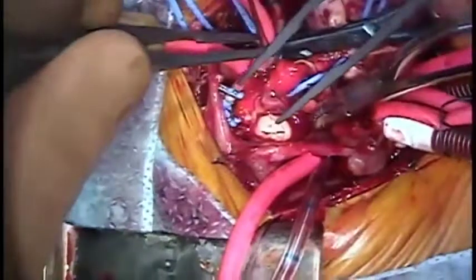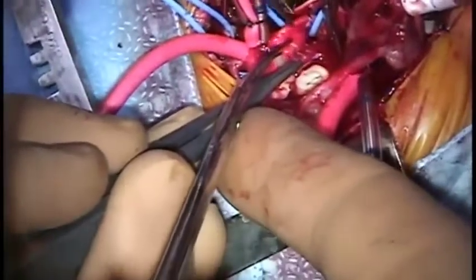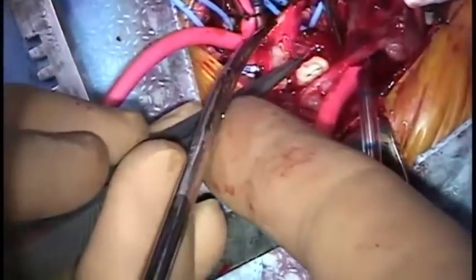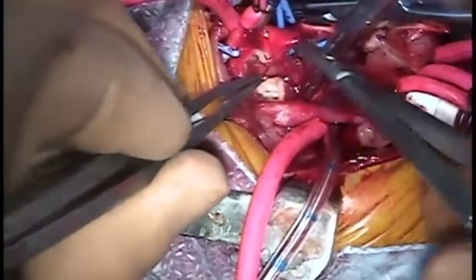There is little mobility of the descending aorta. However, the earlier dissection of the aortic arch branches allows the arch to be brought down to the descending aorta, as you can see here. The suture line is started at the caudal end of the incision. Anterograde head perfusion is started at this time.